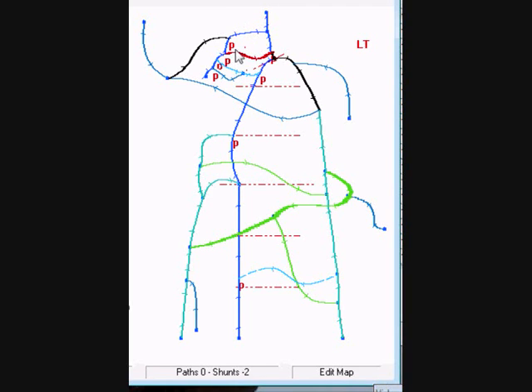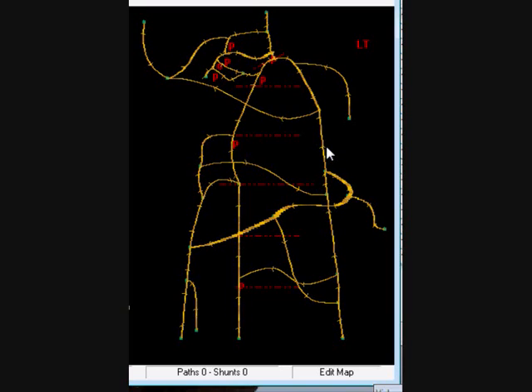A Haemodynamic Venous Map of the left lower limb was performed to detail the features of the venous network. You can see highlighted in red a medial circumflex femoral vein, the common femoral vein, and then the GSV. A computer simulation showed the flow behavior over the mean of a systo-diastolic manoeuvre.